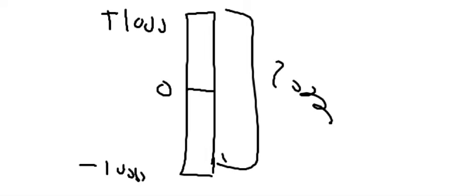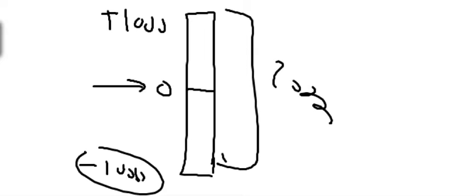Now, the density of water: if we put water in the CT scan, the density is 0. The shade of gray of water, we will give it 0. And the density of air, if we put air in the CT scan and make an image, we will give it minus 1000, which is the lowest density in the human body. And the density of bone, the cortex, the densest part of the human body, we will put plus 1000. Okay so far? So from minus 1000 air to plus 1000 dense cortical bone, and at the middle is the water. Okay?